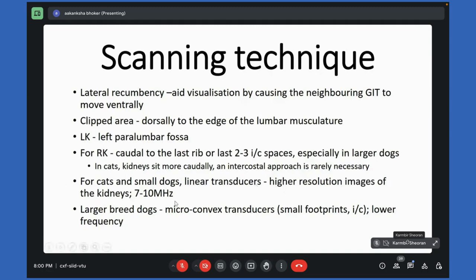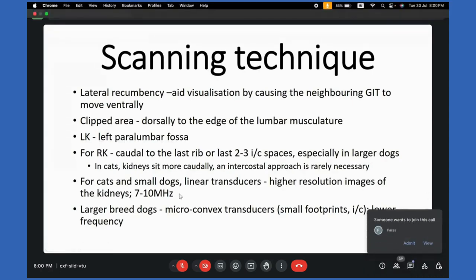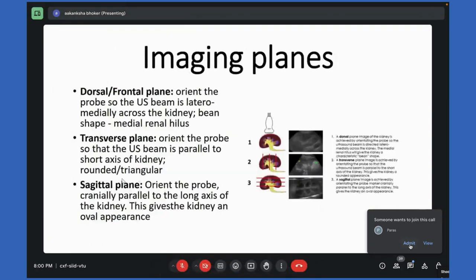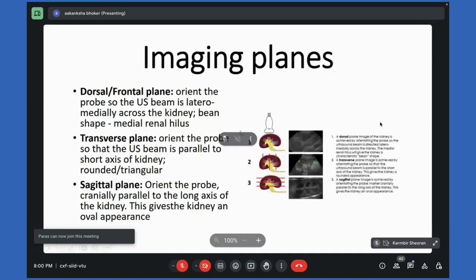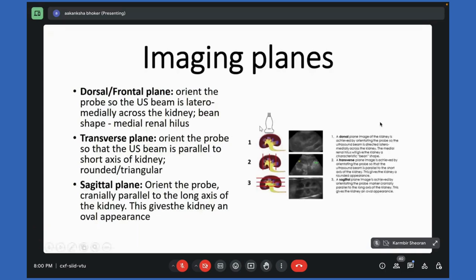For the transducer, for cats and small dogs, we can opt for a high frequency transducer, whereas for large breed dogs, a low frequency transducer is used. So these are various techniques. I told you about different planes. The kidney should be imaged in 3 different planes: longitudinal, transverse, and dorsal. This one is the dorsal plane of the kidney, where we will see the renal cortex, then the renal medulla, and the renal sinus. Only the near cortex will be seen; the far cortex is not seen.